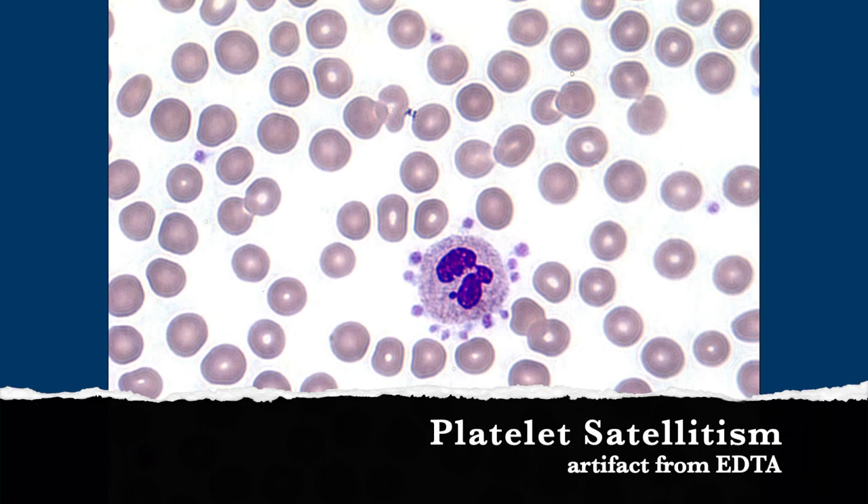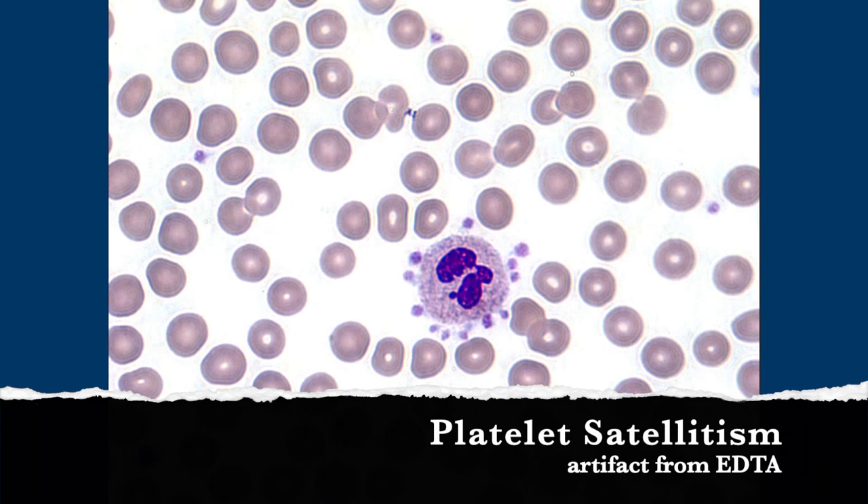Since they're sticking to the neutrophil, they get counted with the neutrophil. So you can also get a spurious thrombocytopenia — you can do the same recollect, because none of these would normally get counted as platelets, but now they won't get counted at all because they're going through the machine with the neutrophil. They're hiding out.